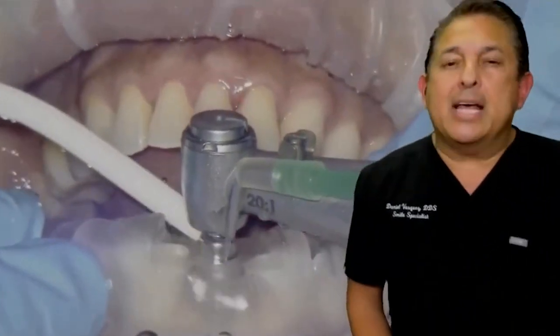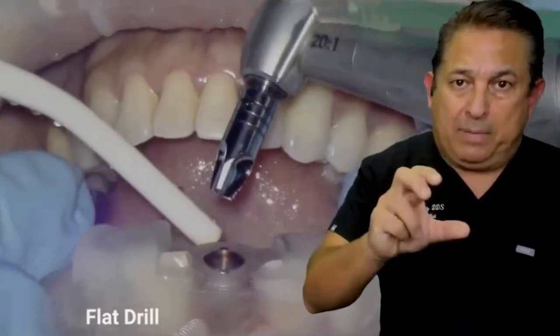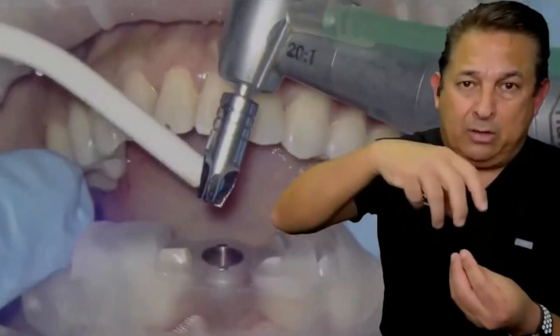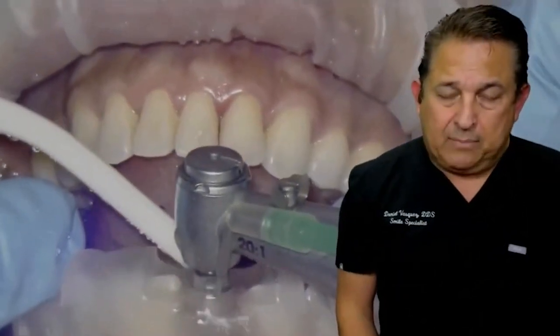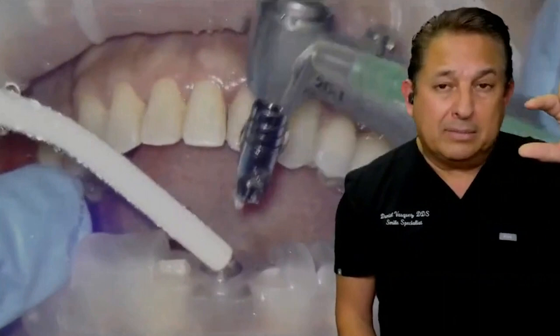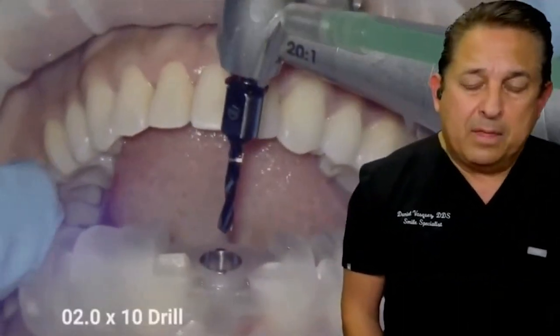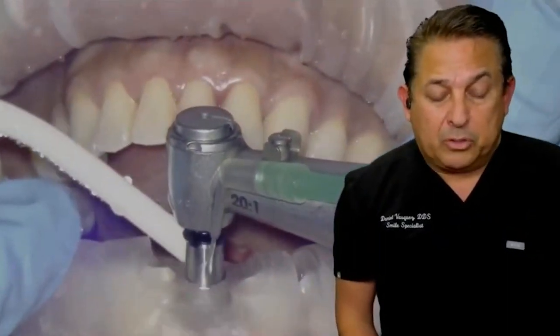We designed this implant, and the company that I use is a Korean implant company. We position the implant, and they fabricate for me the customized permanent abutment. They also design a temporary crown, and they send the core file, the STL file, to me, and I printed that tooth. Okay, so I already have the permanent abutment, and the core file for the temporary crown. Here we find the protocol of the drilling.